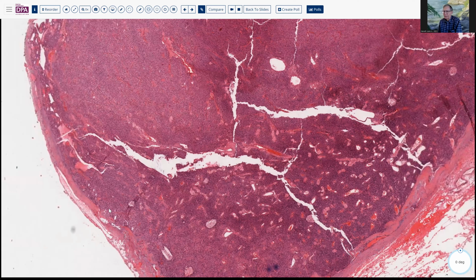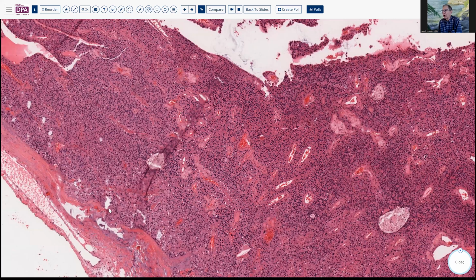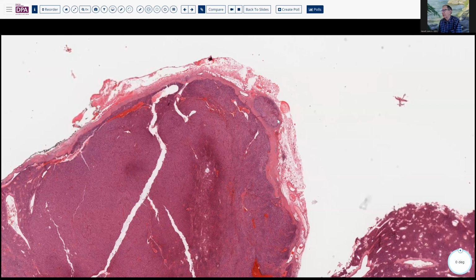parathyroid carcinoma. Now, that doesn't mean that necessarily it's going to be advanced stage and that surgery won't cure the patient in this situation. It's certainly much more likely because this seems still fairly encapsulated, and barring distant metastasis pre-existing at this time, you would make that diagnosis.